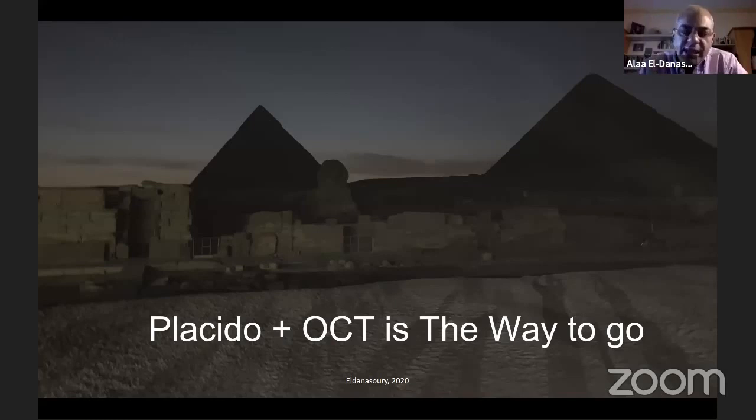the results. And I can confirm that with the OCT, you can detect cases that cannot be detected with Scheimpflug, and with the Scheimpflug, you have some false positive results that show to be absolutely normal with the OCT. When it comes to patients with scatter, like post-cross-linking, or patients with some corneal opacity, the Scheimpflug is totally blind.